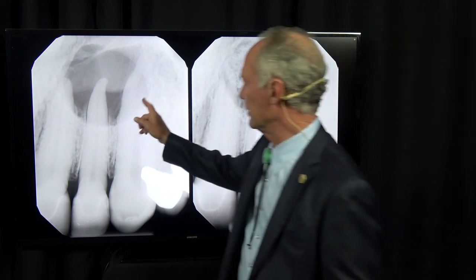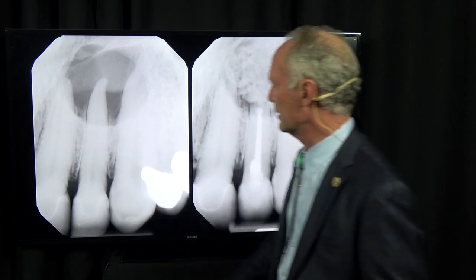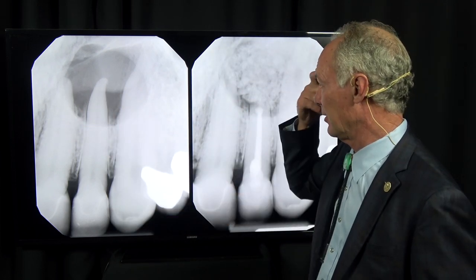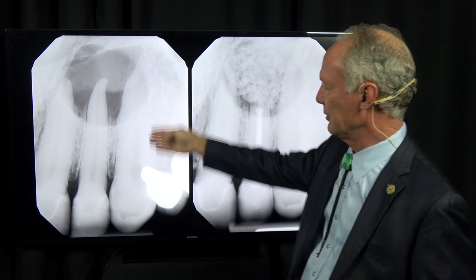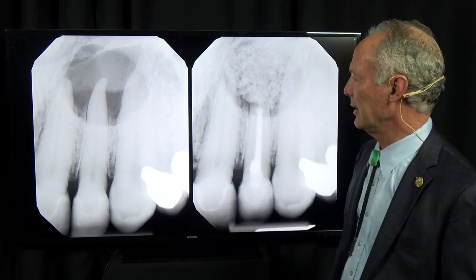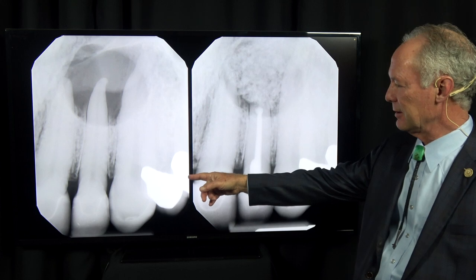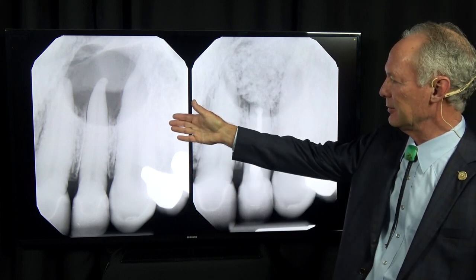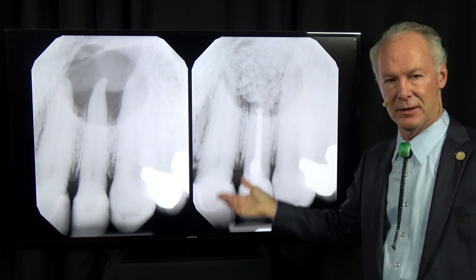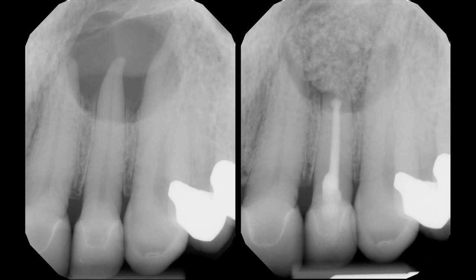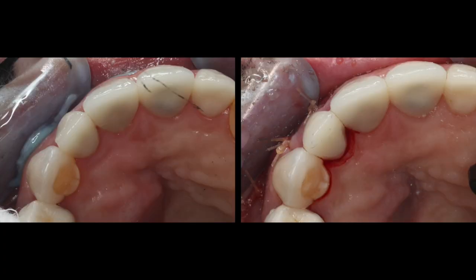I wasn't sure if the adjacent teeth were affected or not. So the patient and I decided to do endo and removal of the granuloma on just the lateral incisor and see how the other teeth fared. And sure enough, they were not negatively affected by the granuloma — they were still vital.